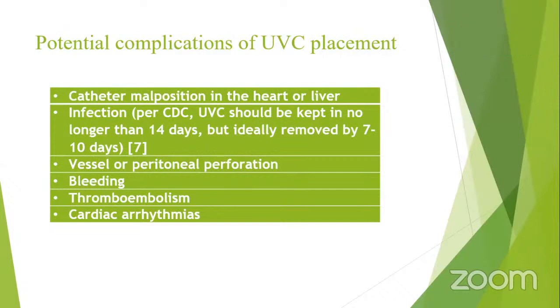Vessel or peritoneal perforation, bleeding, thromboembolism, cardiac arrhythmia.